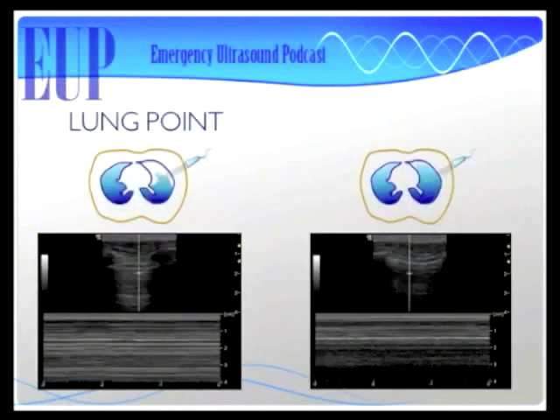So that's pretty cool because we all know ultrasound is way more sensitive than X-ray for pneumothorax. But one complaint I always hear from people who are not all that big on ultrasound, usually because they don't really get it, is that ultrasound may be too sensitive. Can you pick up pneumothoraxes that are too small? But you're telling me you can actually estimate the size of a pneumothorax?